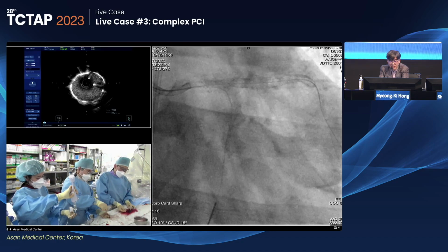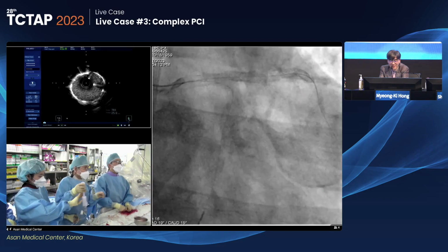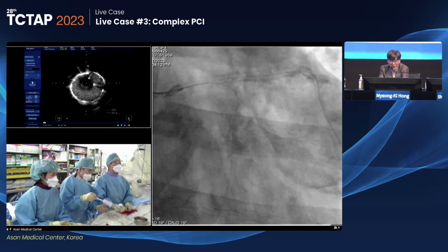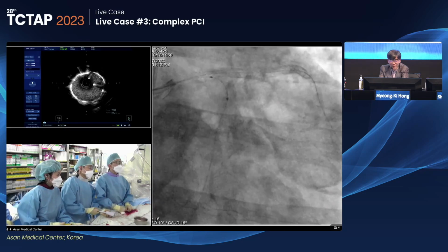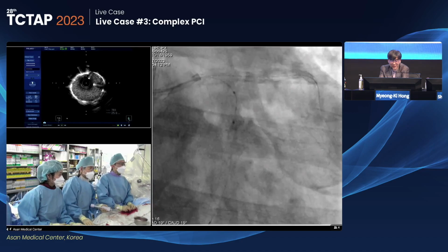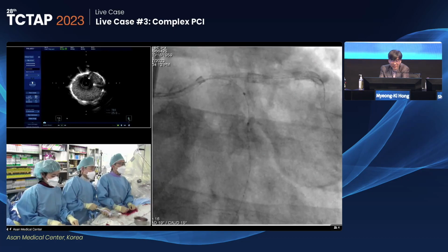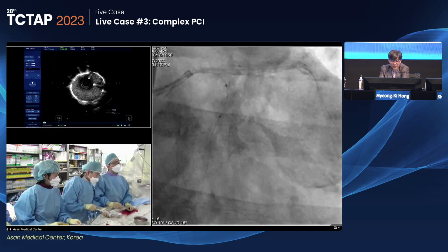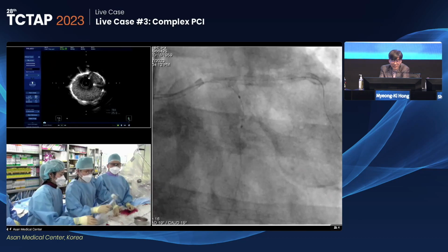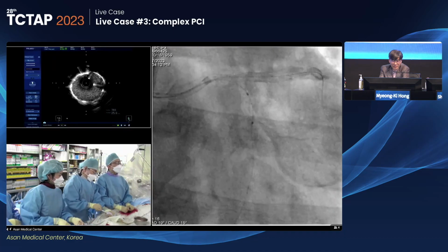My first impression about the angiogram was it looks like a really high risk and a very difficult region. But I think you have a very skillful hand so far. Everything is just fine. Excellent procedure. We'll open the distal region with a 2.5. The vessel size is not so large. 12. 12.